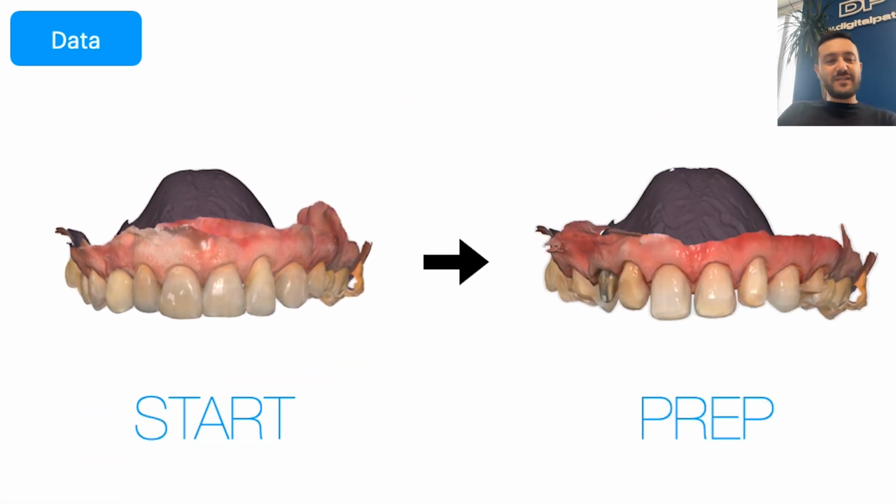And so the patient agrees with the plan. It is time to grab the bur and start prepping the teeth.